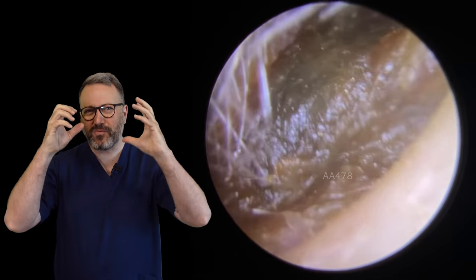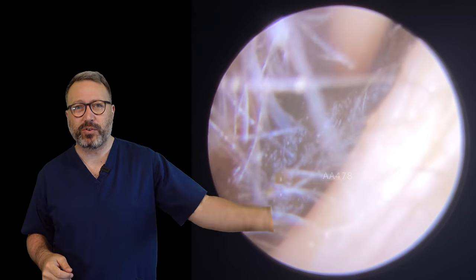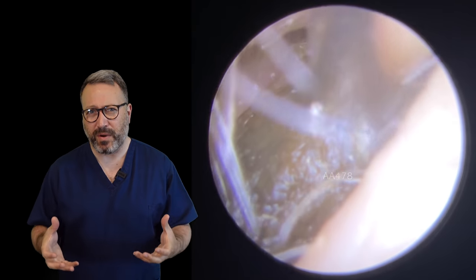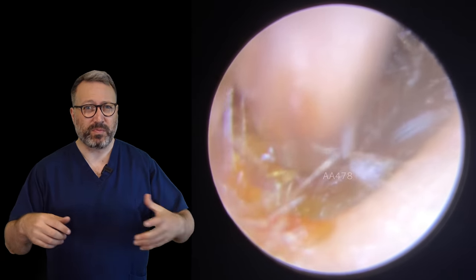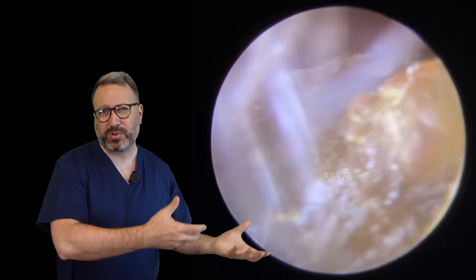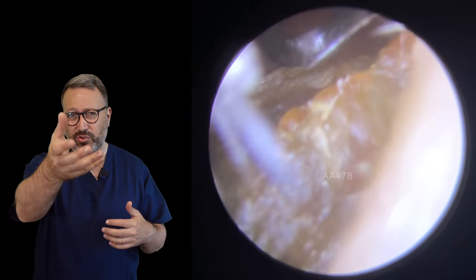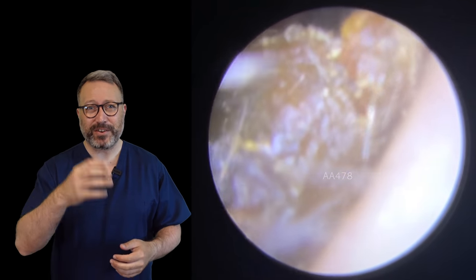This patient came through with a really, really tough earwax. We're finding this a lot. We saw one the other day where we had hairspray-hardened earwax. We're seeing a lot of patients with this really tough earwax at the moment, or very soft earwax. We tend to get extremes because earwax removal services are not being carried out at the GP, and the hospital service isn't quite back up and running yet because of post-COVID. A lot of patients have gone much longer before they get their wax removed, so it either dries up like this, or they've thrown everything but the kitchen sink to try and get it out, so it tends to be very, very soft.